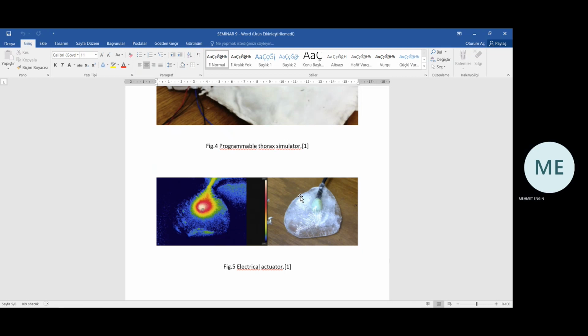Now, comparison with patient thermal image. A thermal image of a patient was chosen. This patient is part of the study group of ages ranging from 40 to 45 with infiltrating ductal carcinoma. This thermal image was analyzed using Fluke tool software.